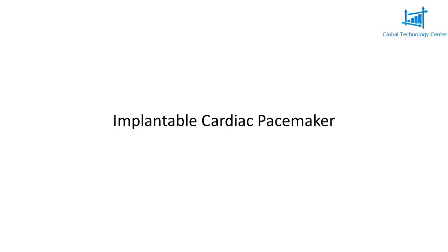An implantable cardiac pacemaker is supplied with a battery fitted and sealed into the device. Due to self-discharge, all batteries have a limited life even if not used. The period for which the battery maintains sufficient energy for the device to function as intended by the manufacturer following implantation is important to avoid the need for a surgical operation to explant and replace the device unnecessarily soon.